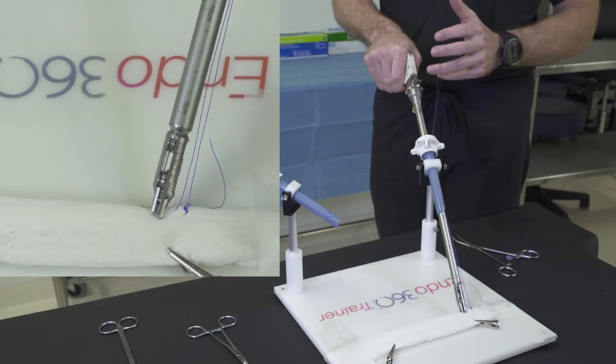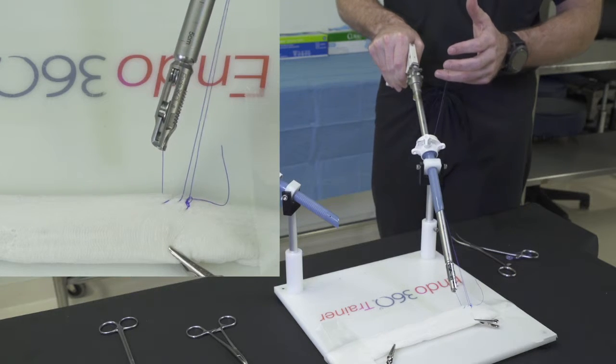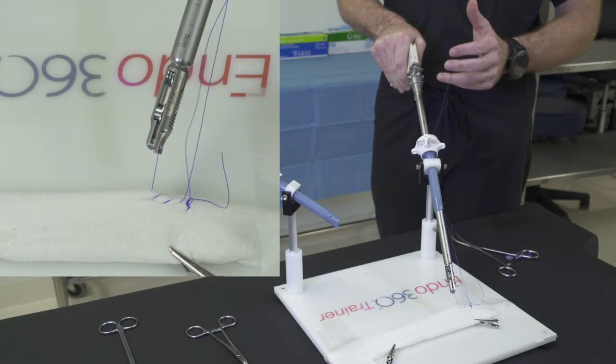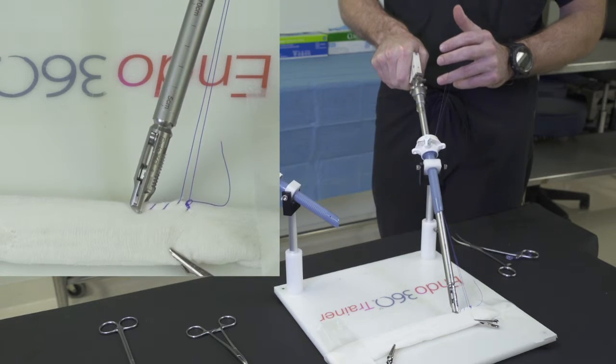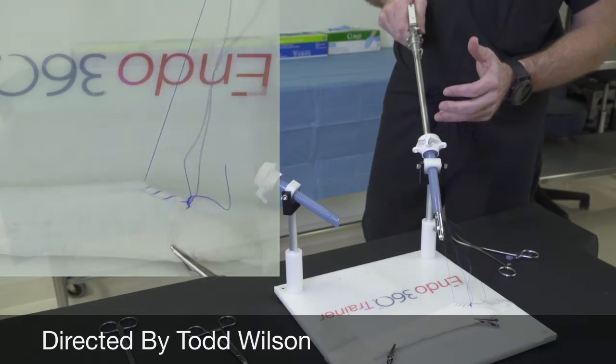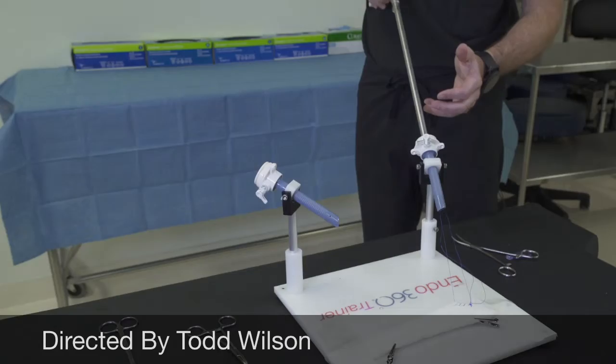I'm going to travel a little bit, take my next bite, travel a little bit, take my next bite, and usually I can do this anywhere between 3 and 5 times before I'm running into so much tension that I can't really pull it tight.